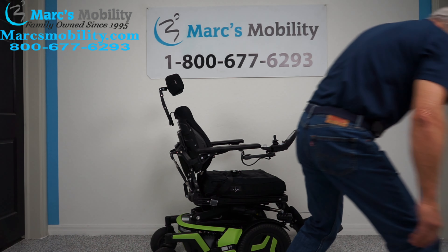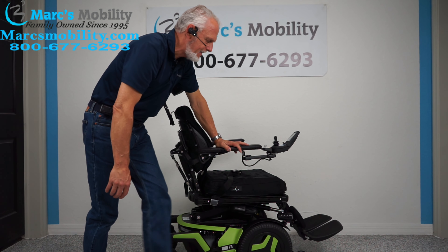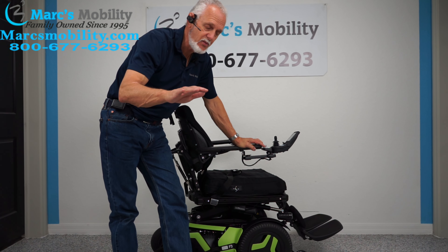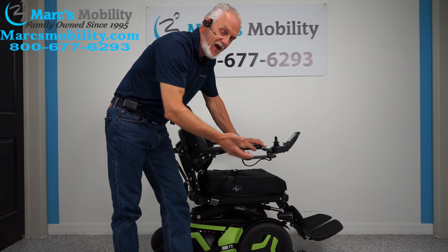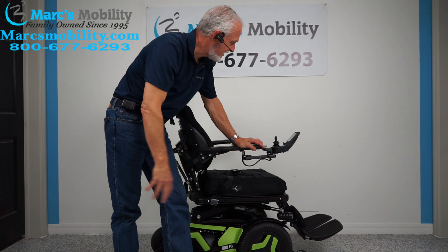You have two batteries in here and they come out from the back. They're supposed to give you about 15 miles on a battery charge, but that varies for everybody. If you're going uphill, outside in the grass, driving fast, or using the seat lift to tilt, you may not get 15 miles — but that's a long, long ways anyway.